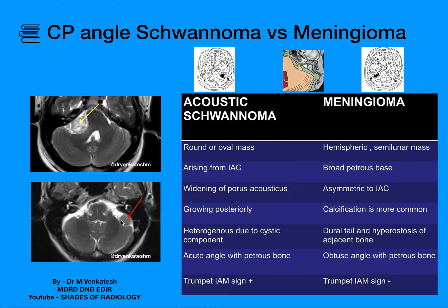Coming to the other case, you can see a well-defined lesion slightly posterior to the left CP angle which is extra-axial and causing indentation over the left cerebellar hemisphere. So this is a case of right acoustic schwannoma and this is a case of left CP angle meningioma. Let us see the differences between schwannoma and meningioma in the CP angle, as these two are the most common lesions in the CP angle.